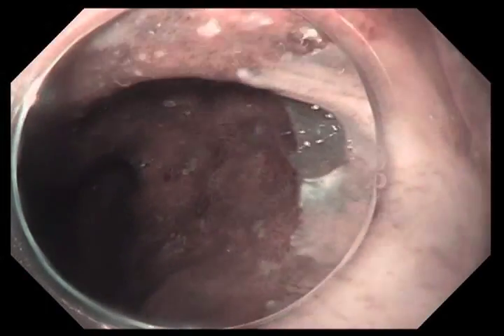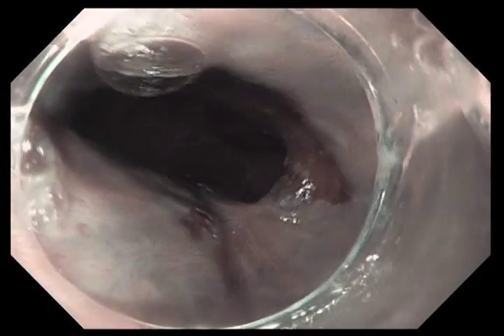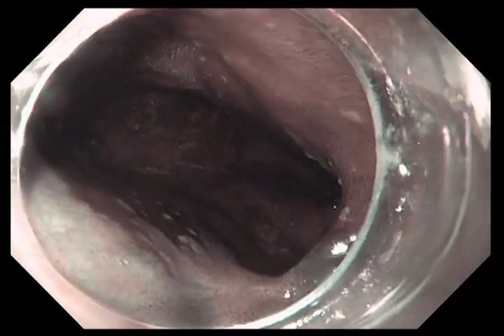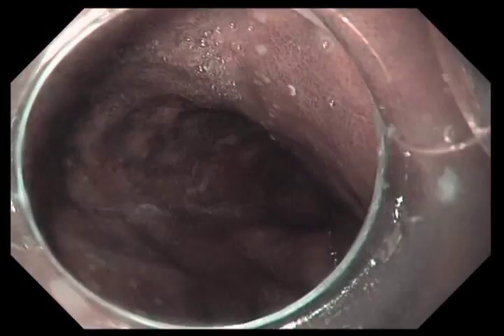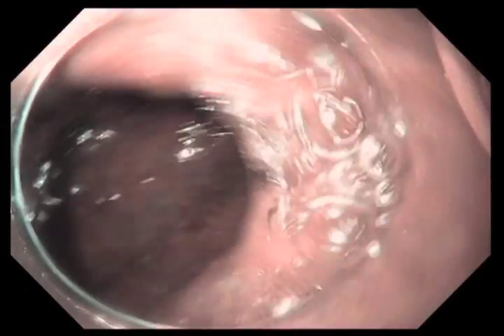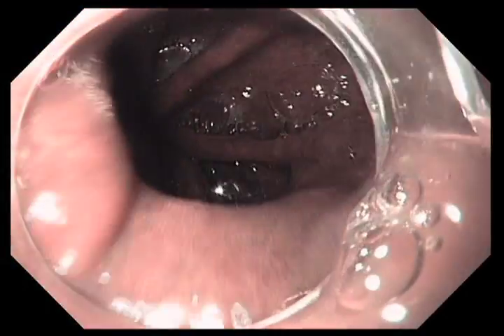We also want to examine the esophagus to make sure that it's smooth. The radio frequency ablation technology can only be used on Barrett's epithelium that's smooth — in other words, not nodular. This is a long segment Barrett's. At the proximal edge you can see some scarring, which is from a prior endoscopic mucosal resection. We're going to avoid that area of scarring.